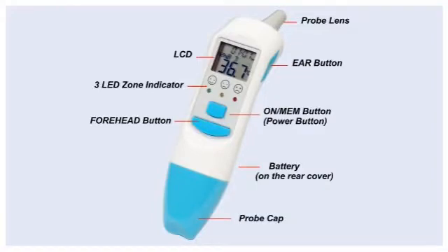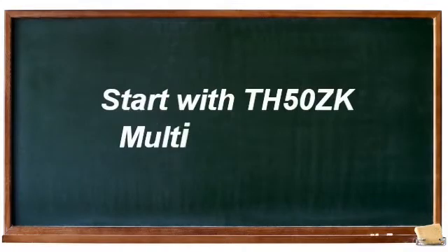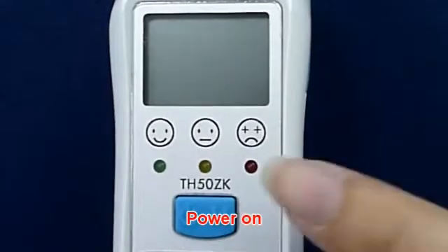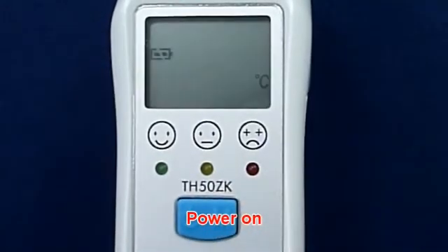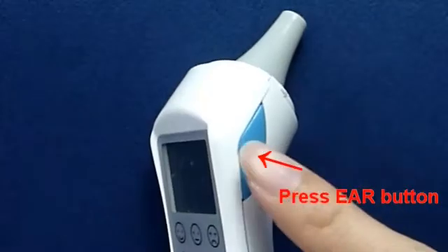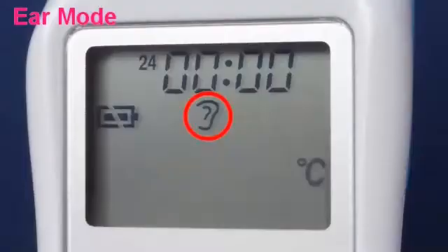Referring to the part names: press the On Memory Button to power on the device. Then press the Ear Button — you can see the Ear Icon on the LCD screen.